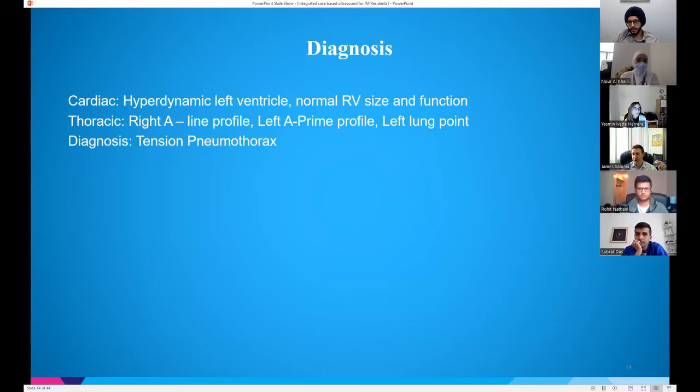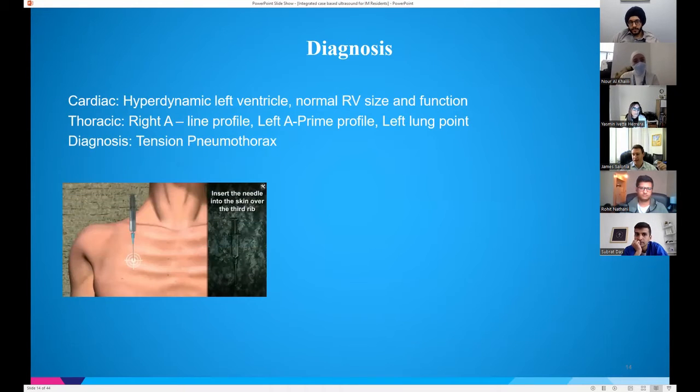So tension pneumothorax. So definitely, this is what you want to do. This is easy, much easier than putting in a chest tube. Chest tubes take time, at least for me, like 8-10 minutes, if you're going to do it sterilely. We had to throw in an emergent surgical chest tube in the ICU the other day, but you can do it emergently, but that's not ideal.